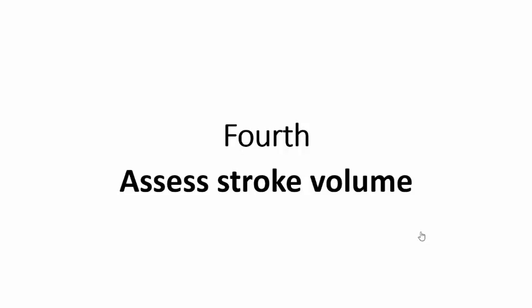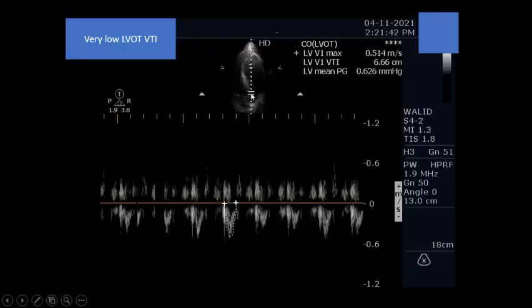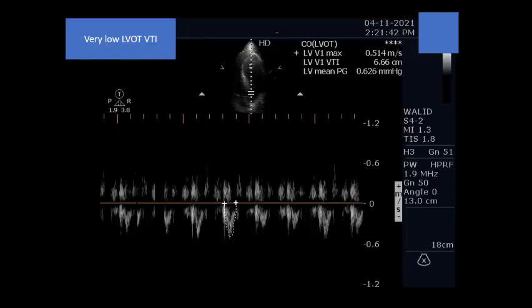Step four: obtain the baseline stroke volume — or at least the baseline LVOT VTI, which is a surrogate of stroke volume — because this baseline will be used for follow-up to detect any improvement. Place the pulsed-wave Doppler at the left ventricular outflow tract and trace the Doppler flow to calculate the LVOT velocity-time integral. Normal LVOT VTI is 18 to 22 cm. In our patient, it is 6.6 cm — very low — indicating critically reduced stroke volume.